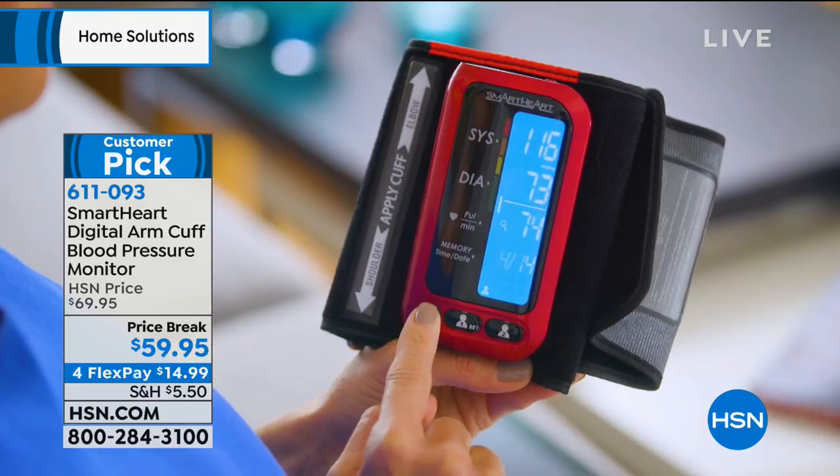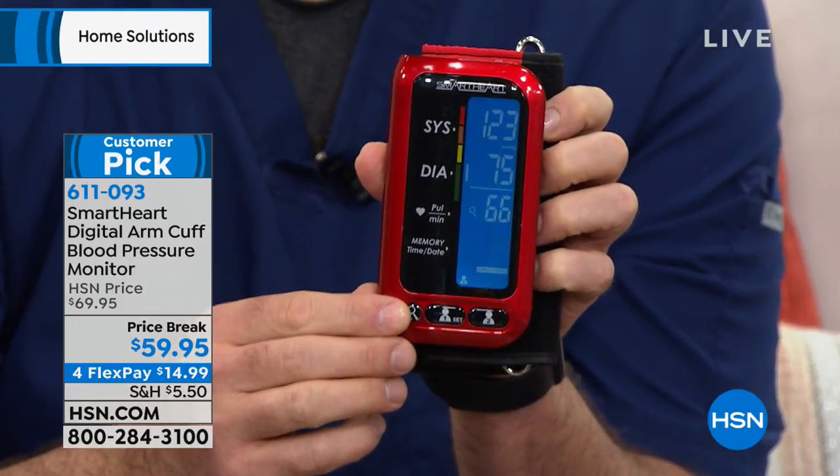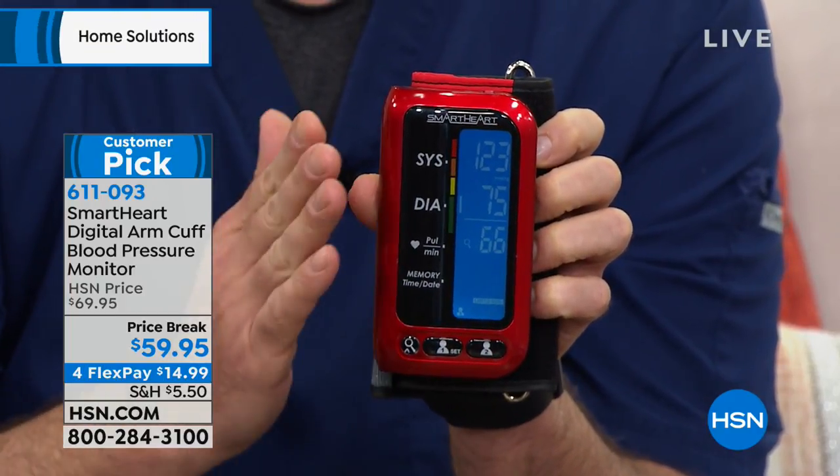So why does everybody love this blood pressure monitor so much? We have an epidemic here in this country, and what this does is it helps you get your head out of the sand. This is a brand new technology unit from Smart Heart. You'll see with the features that we talk about here, that this rivals competitor brands that are upwards of a hundred plus dollars. This is the best value I've seen in quite some time in a blood pressure monitor for so many different reasons.